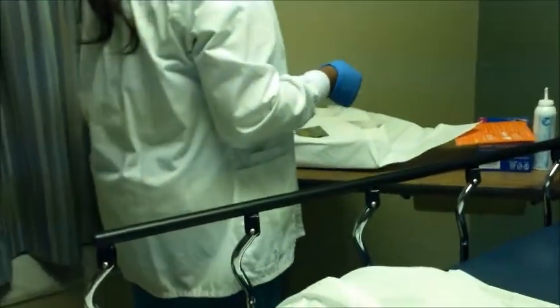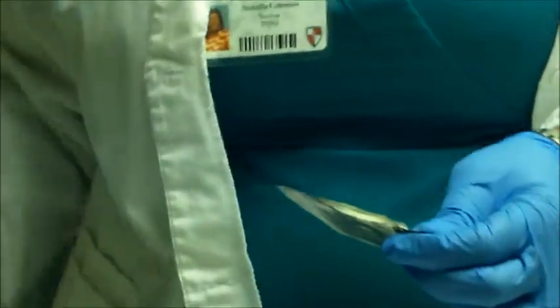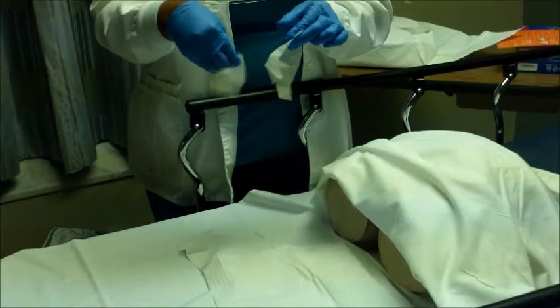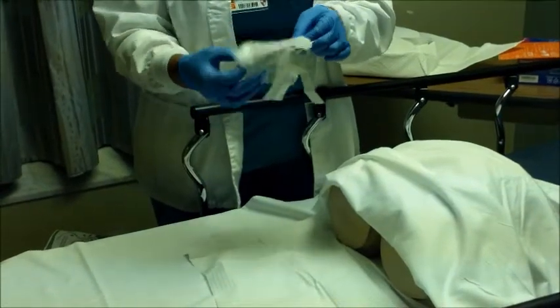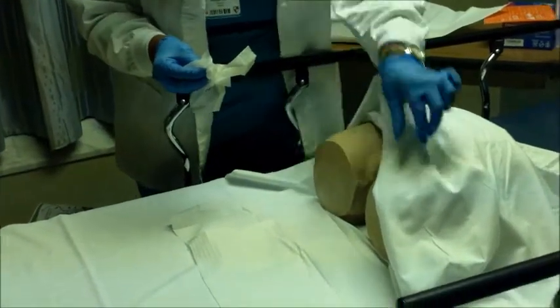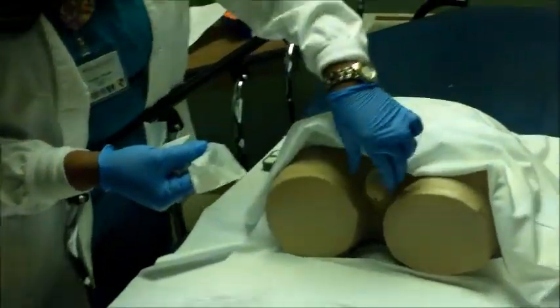Now, I have the soap towelettes that we're going to use to clean the urethral opening and clean around the skin of the penis. There are 3 towelettes in here. I like to go ahead and take all 3 out. You want to do this just before you get started to clean the area. Okay, I'm going to uncover my patient. That's the first one.